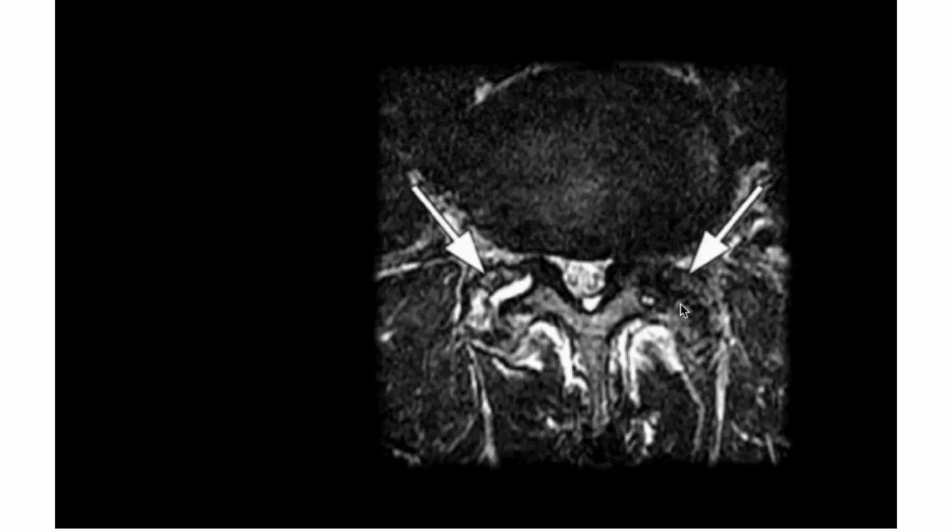What we are doing by ablating the nerves, we are denervating, right? In the same patient, on the right side, I went for the aspiration, and on the other side, I did facet denervation. Both are facet arthropathies, but this is inflammatory, this is degenerative. So your treatment modality will change depending on the findings. Understood?